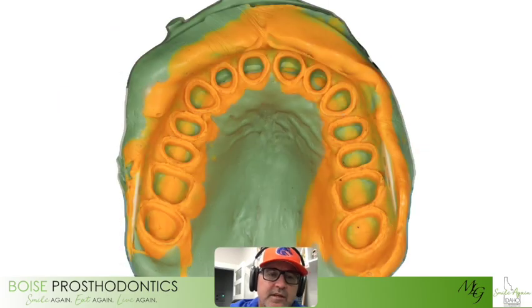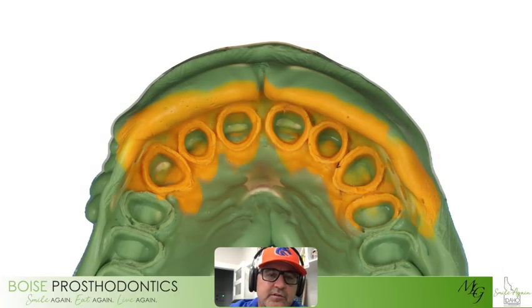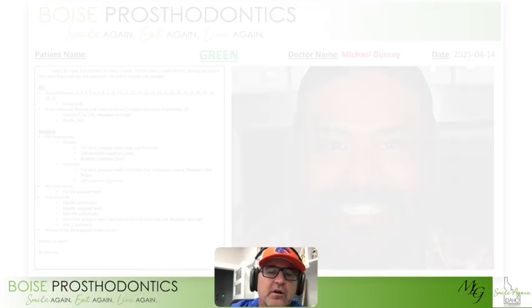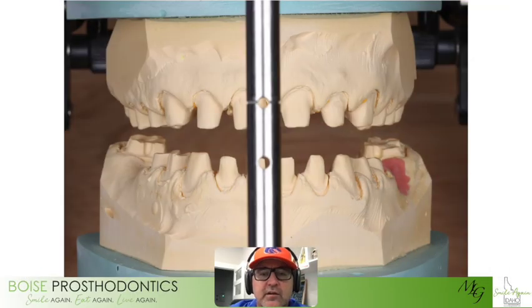We do the upper the same way. You'll see, oh, there's a bubble. That is not appropriate. We need to make sure it's better. So we then make another one and fix those things. Once I'm sure all my records are replicating what is in his mouth perfectly and what we need the lab to do, I'll write a very, very detailed lab script. Again, talking to them, sending them everything they possibly could have, so then they can get all the records put together in the lab to create the final restorations.